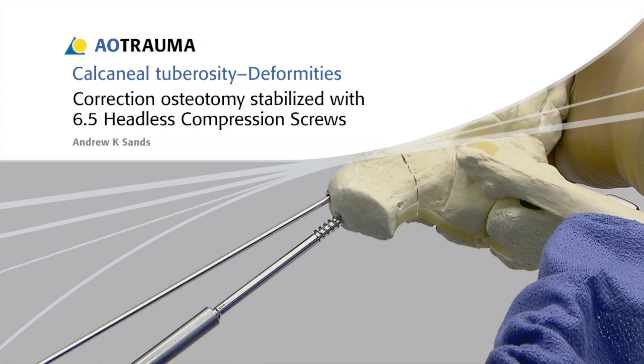In this presentation, a correction osteotomy of the calcaneal tuberosity will be stabilized using 6.5 mm headless compression screws.